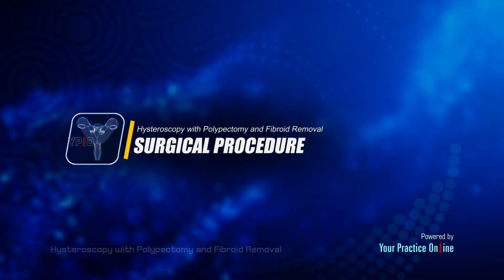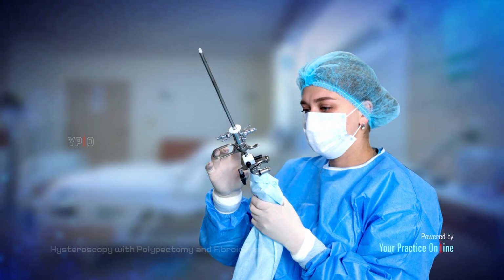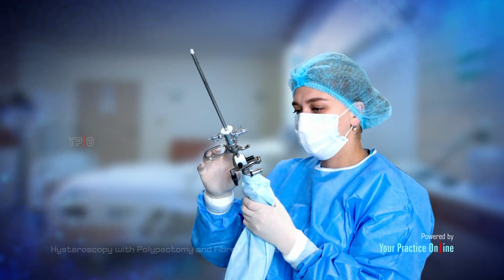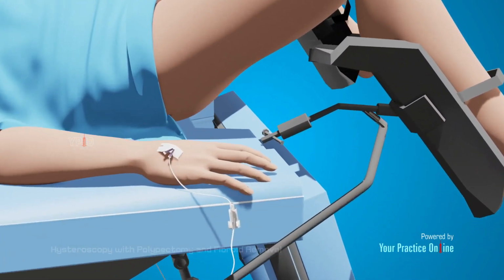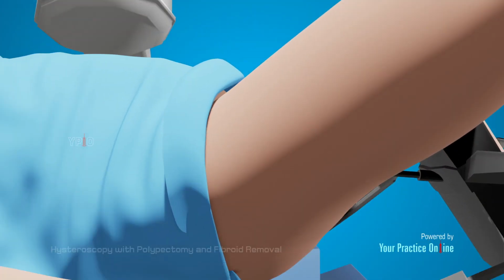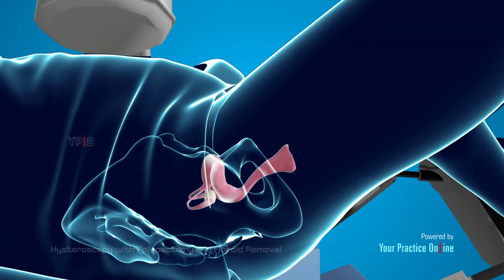Surgical procedure. The general steps for a hysteroscopy with polypectomy and fibroid removal include the following. You will be placed in a supine position with your legs slightly apart and knees slightly raised. The choice of anesthesia, either local or general, depends on your doctor's discretion. The cervix, the opening of the uterus in the vagina, is dilated by inserting medication or using special dilator instruments.